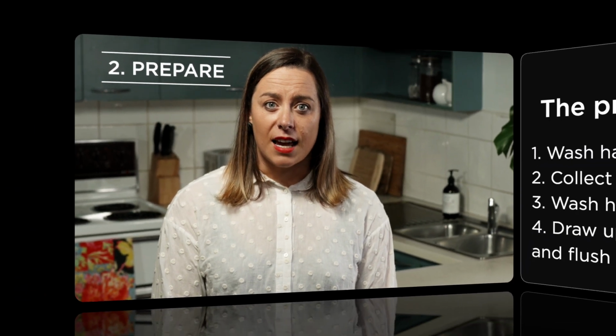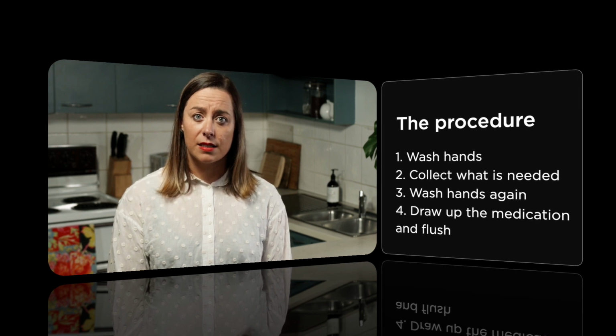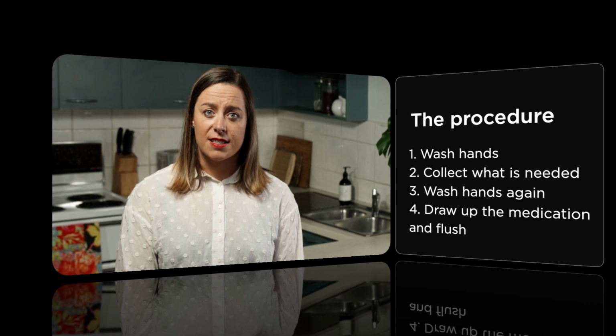Phase 2 is prepare. This stage involves washing our hands, collecting what we need, washing our hands again, and drawing up the medications and flush. Using a clean container, collect everything you'll need from the medication pack provided to you by the Palliative Care Service.